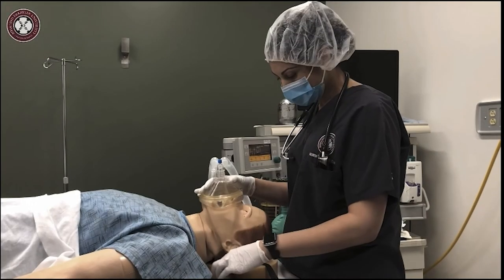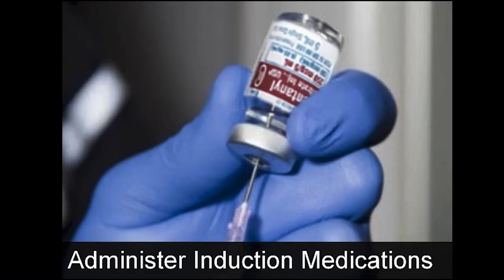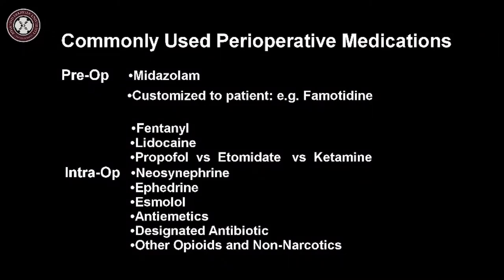Straps can be used to help ensure a good seal between the mask and the patient's face. If satisfied, now administer induction medications. Here's an example of commonly used perioperative medications. The next screen shows a list of commonly used perioperative medications as well, and there is a lot of content on this screen, so please feel free to pause and review.